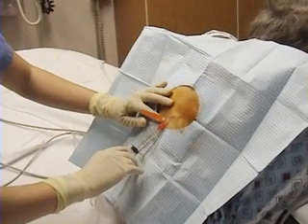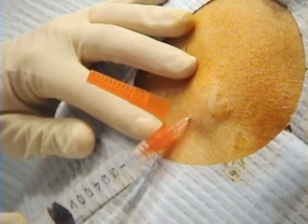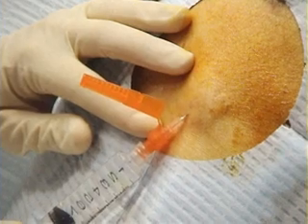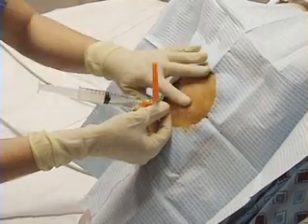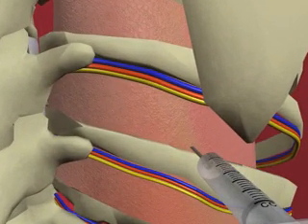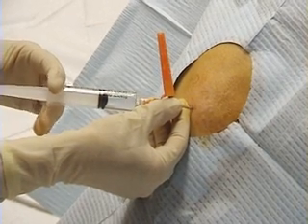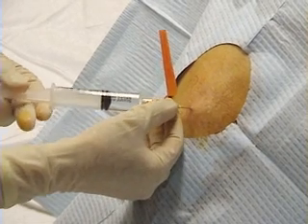Using a 25 gauge needle, place a wheel of local anesthetic such as lidocaine along the superior edge of the rib that lies below the selected intercostal space. Switch to a 22 gauge needle and begin to anesthetize the deeper tissues. The inferior surface of the rib must be avoided, since the intercostal vessels and nerve are located in this region. At this point, walk the needle over the superior aspect of the rib, alternately injecting anesthetic and pulling back on the plunger as you advance.